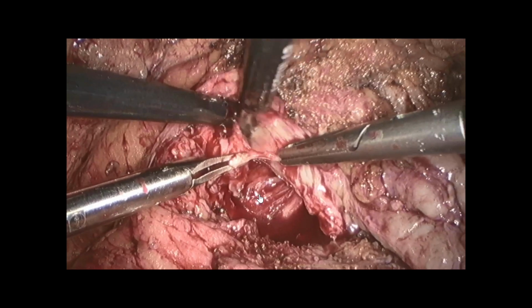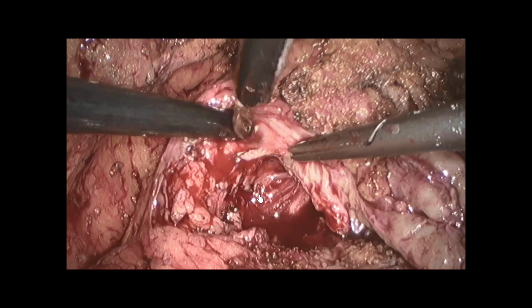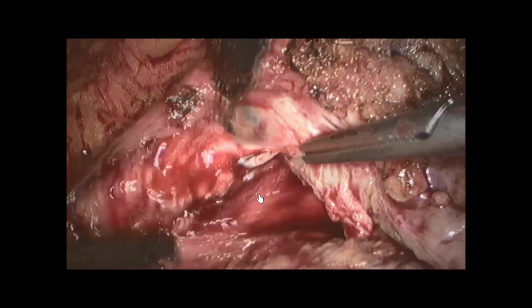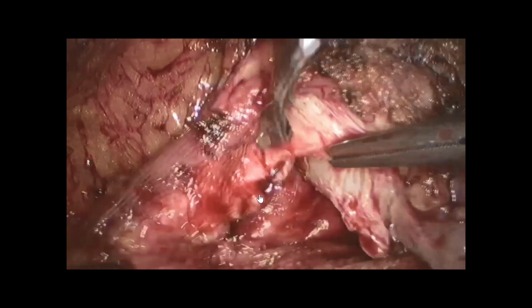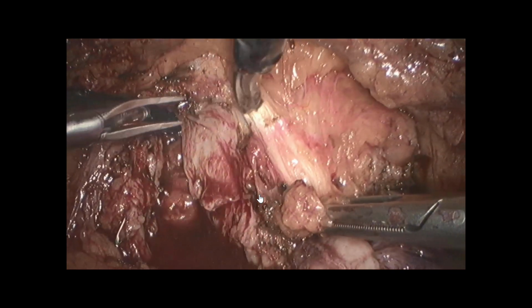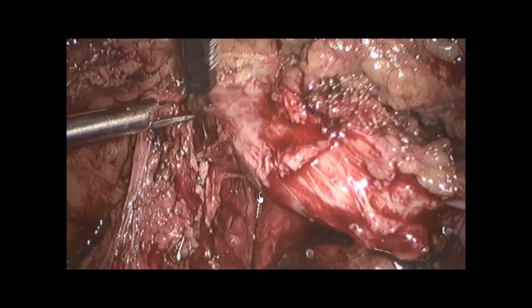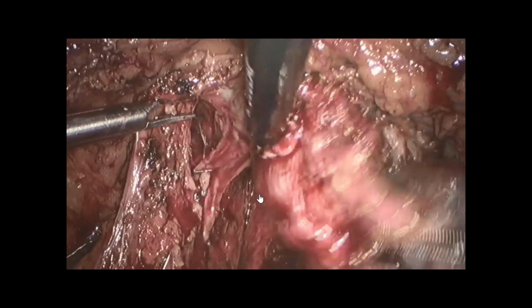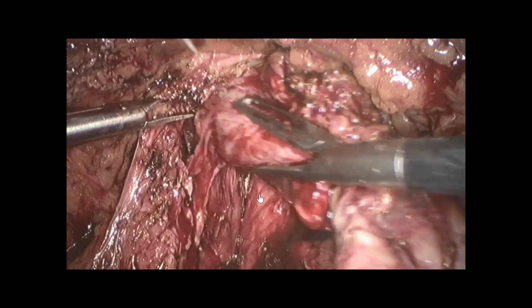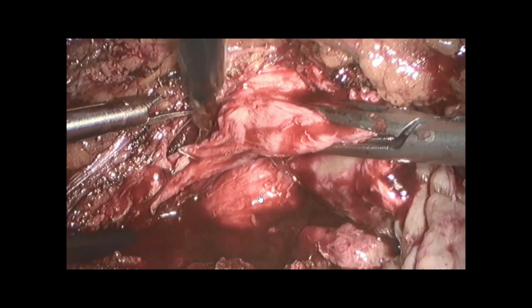And slowly, here I am intrafascial. You will see I'm very, very close because we want to preserve as much as possible. So you see perfectly, you see the gland, and here you can't do this surgery if you have a positive margin or a positive biopsy. But if you want, you can do this surgery for really, really important preservation. So you see here, go on.